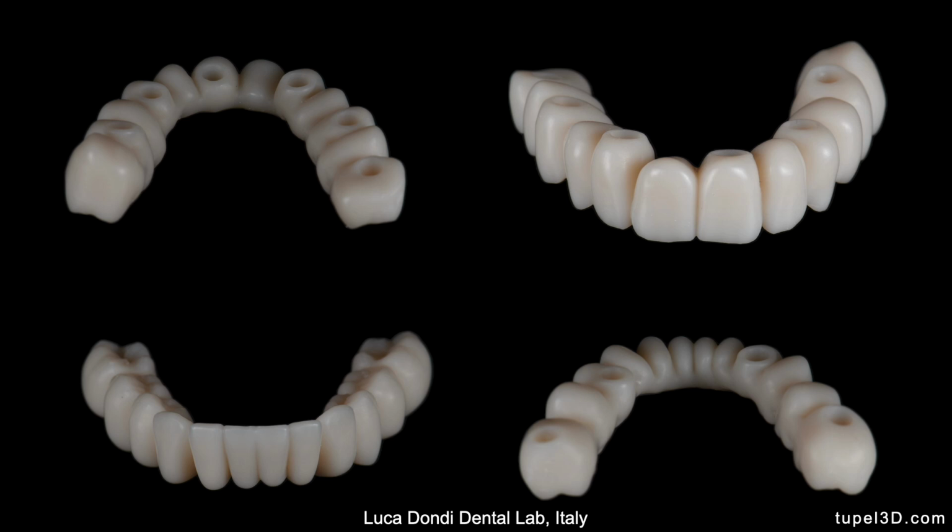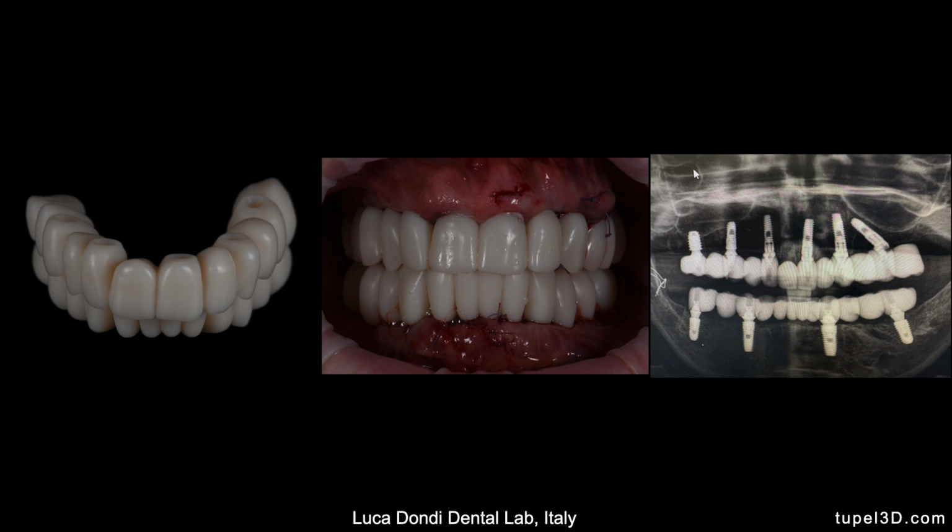So it's very important. The way I do now is basically guide my technician to create an adequate pontic surface, an adequate emergence profile, okay. And then you can see here how with the interim restoration we're able to address the majority of the issues that were present in the initial situation. So we're able to correct the occlusal planes, the midline, and then obtain an adequate fit of the prosthesis and also guide the soft tissue, okay.